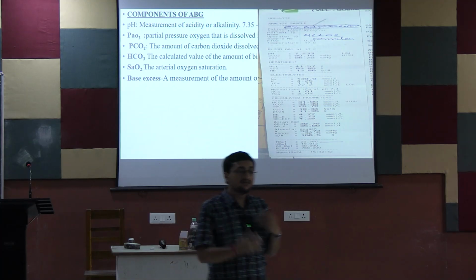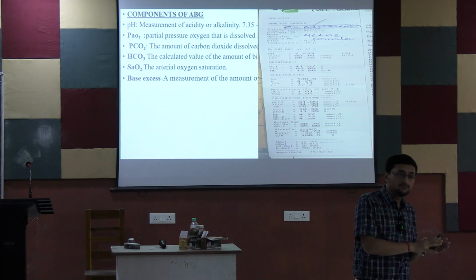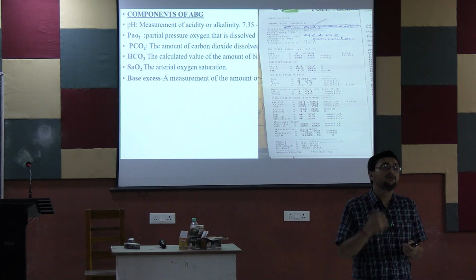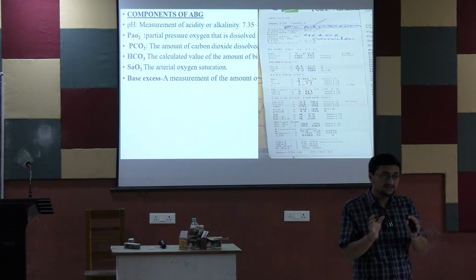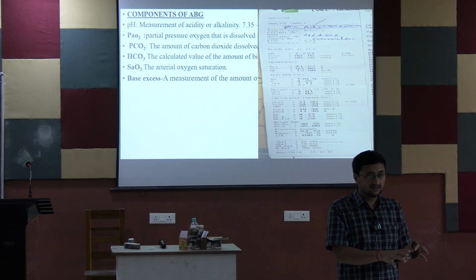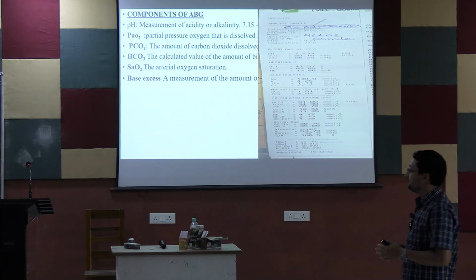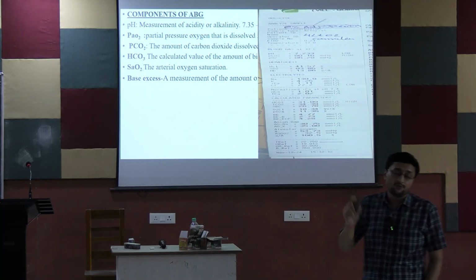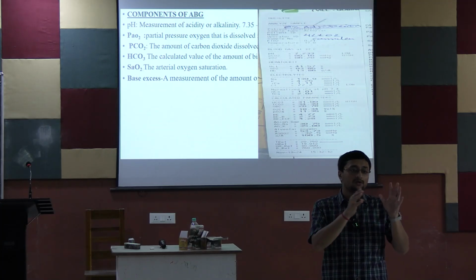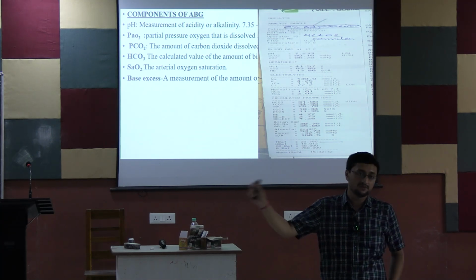But the ideal value does not always match with the normal blood values. Basically, the value of potassium changes depending on many parameters. How you are drawing the blood, you are using the tourniquet or not, right? And if you heparinize the blood more than is needed, all these things may falsely hinder the sodium potassium balance, right? So sodium potassium estimation is important from your ABG, but don't blindly rely on that. Side by side, always send the blood for sodium potassium.